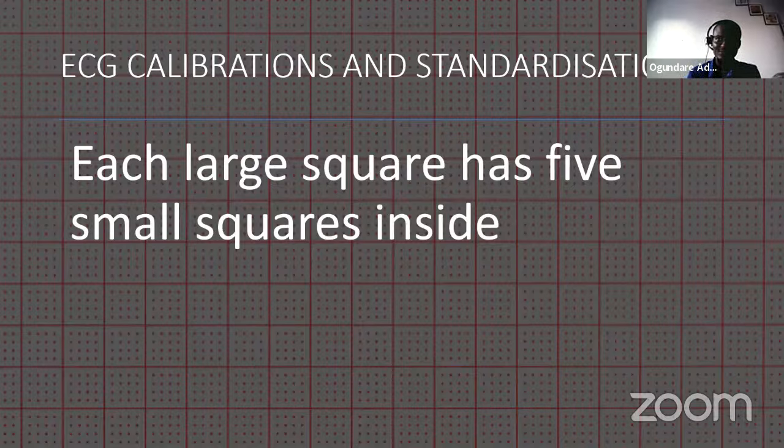I can tell you now that you can successfully understand the interpretation of ECG. To be honest with you, not many textbooks will simplify it for you this way. They will just give you, like a memory verse, that a large box is 5 millimeters, it's 0.2 seconds.